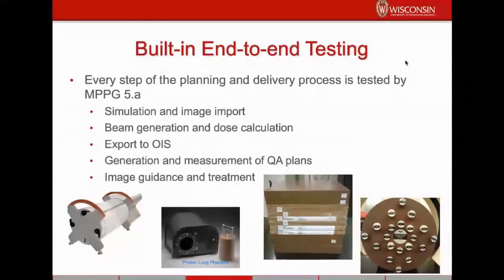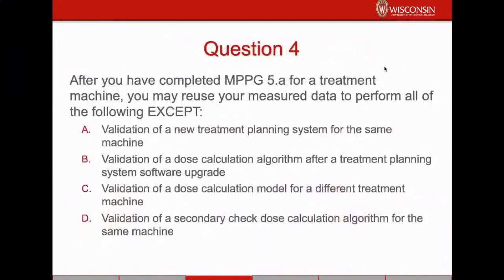And this built-in end-to-end testing is invaluable because it gives you a lot of confidence in your tools and your techniques and really gets you ready for using a new system. All right, question number 4.